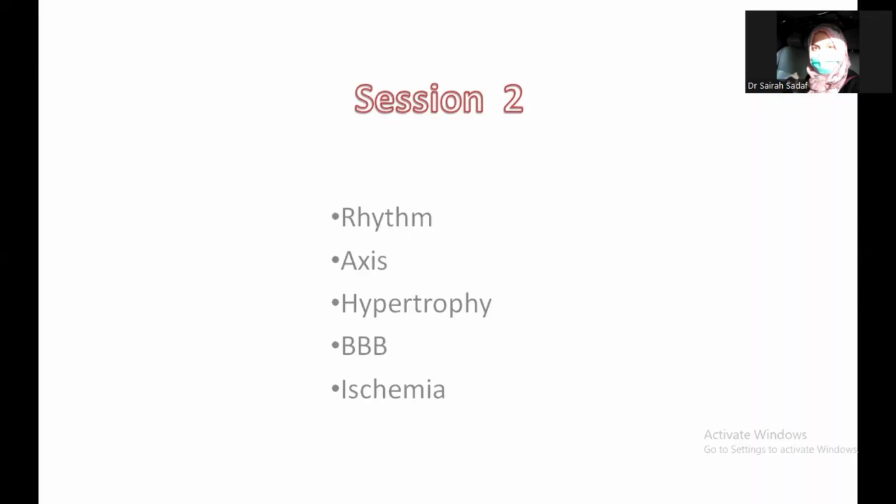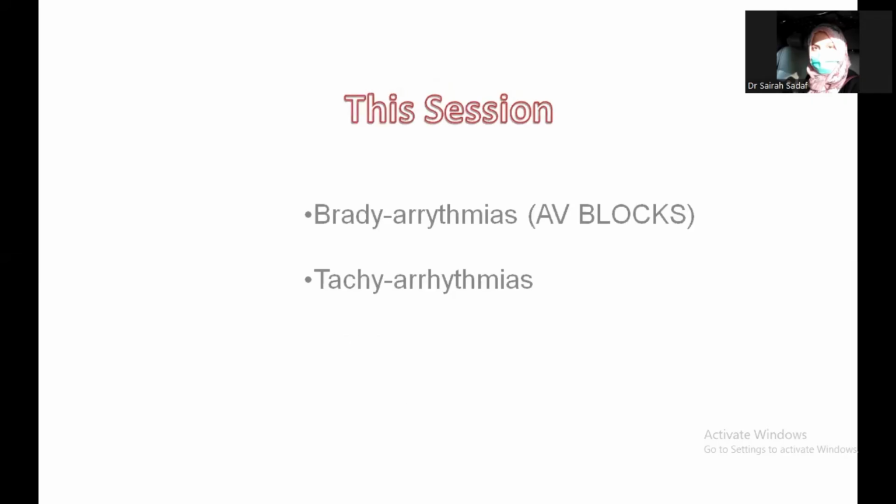We have been through rhythm identification, axis, most importantly hypertrophy, bundle branch block, and ischemia. So today, this session is about the arrhythmias, the bradyarrhythmias and tachyarrhythmias. In bradyarrhythmias, we will go through AV blocks, and in tachyarrhythmias, we have a lot of arrhythmias. So let's tackle each at a time.